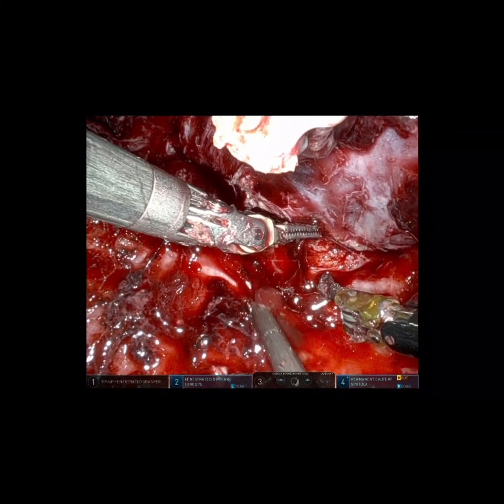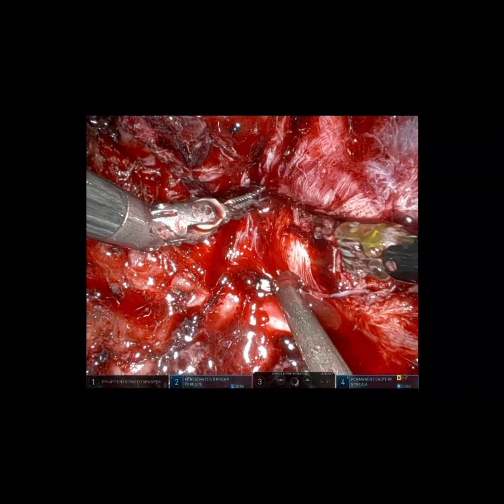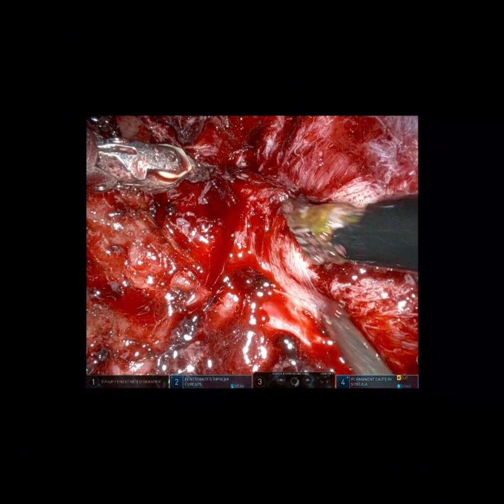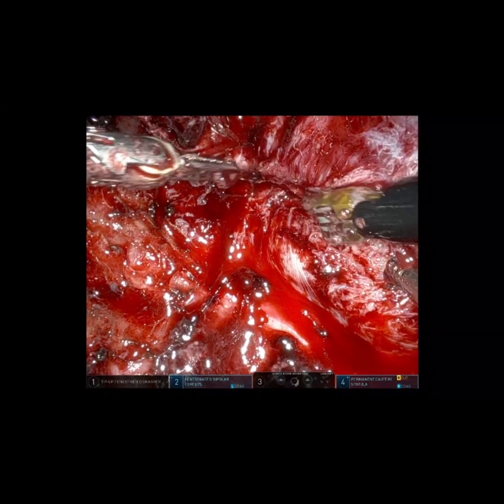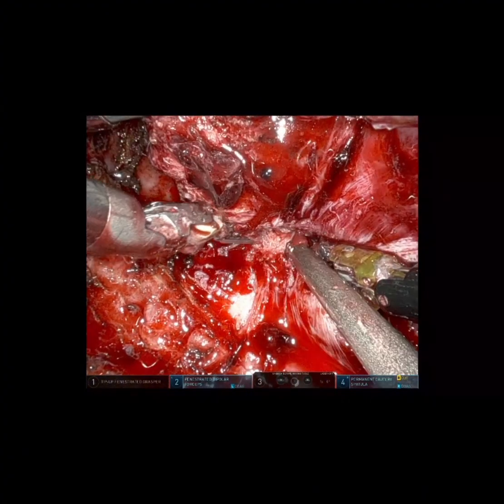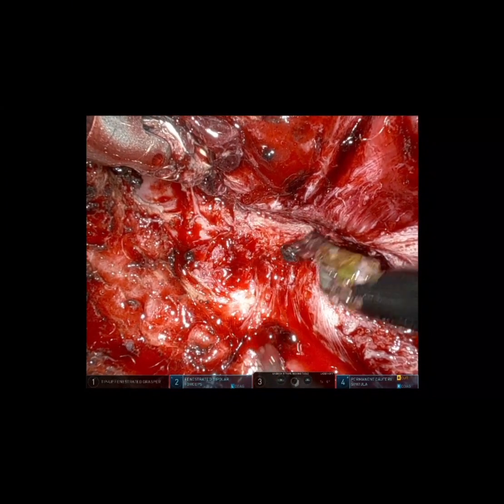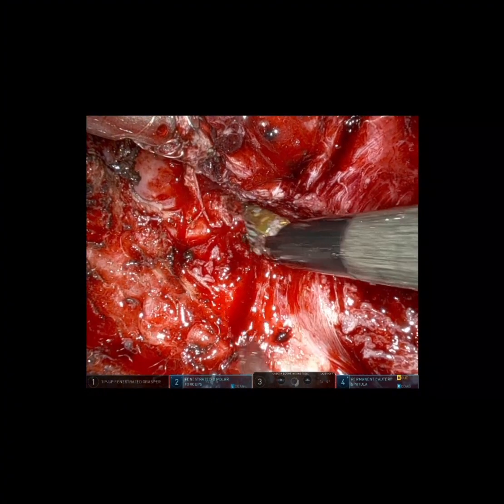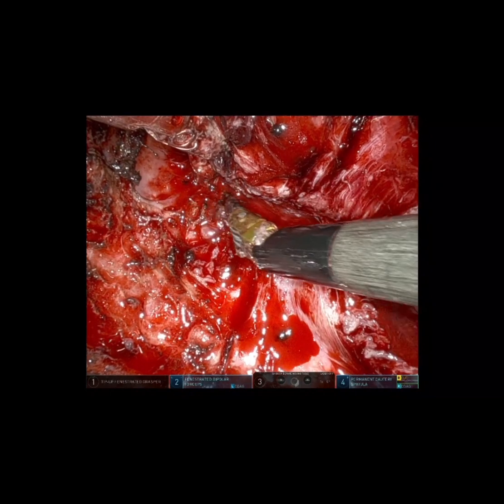And look, there's tumor just plastered down to the esophagus. So we're going to put a scope down the esophagus and then use the ICG camera. We don't give ICG. You don't need to give ICG. But you can see that we're leaving tumor here all over that posterior mediastinum, a little bit of tumor because we knew it was going in the chest wall. We know we're not going to get a complete resection. We're trying to get this out to save his life. This is the reality of a toilet pneumonectomy and doing a non-R0, R1, almost even an R2 resection in a patient who's critically ill with hemoptysis with pus pouring out of his chest.